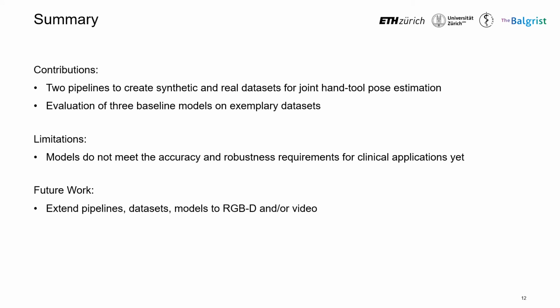To conclude, we contributed 2 pipelines that can be used to create synthetic and real datasets for joint hand-tool pose estimation. We evaluated exemplary datasets on 3 baseline models. The best performing model achieves an average 3D vertex error of 13.78 mm.